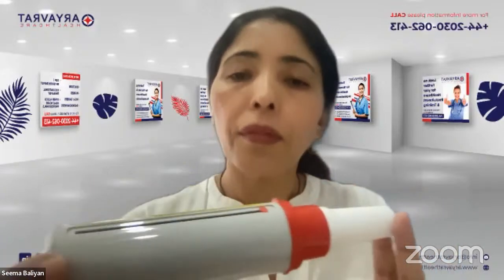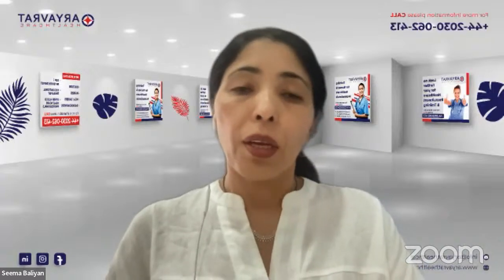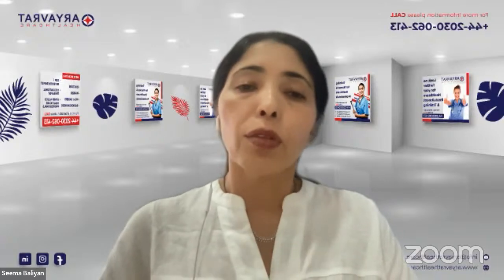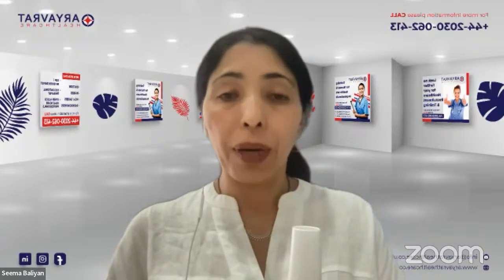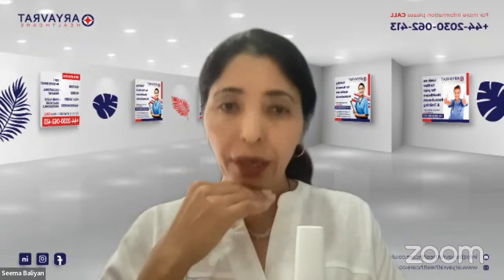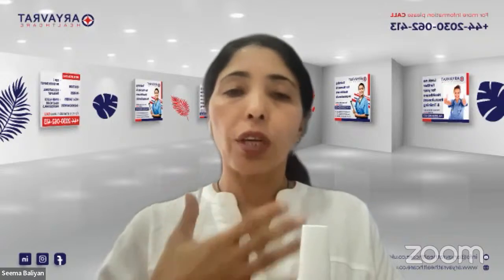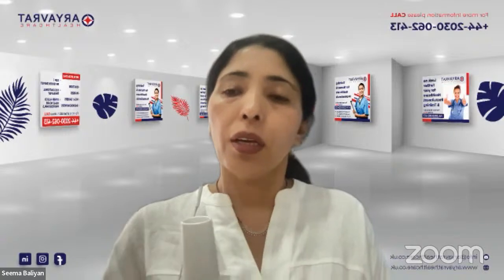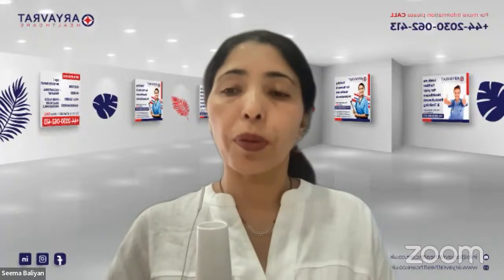Yes. Okay. So now we are going to come to the next question, which is the position. What is the best position to use a peak flow meter? The best position is that you should be sitting or standing in an upright position, and your neck should be neutral, not bending or extending. The upright position gives our lungs the full chance to be inflated and for you to take as much air as possible inside.